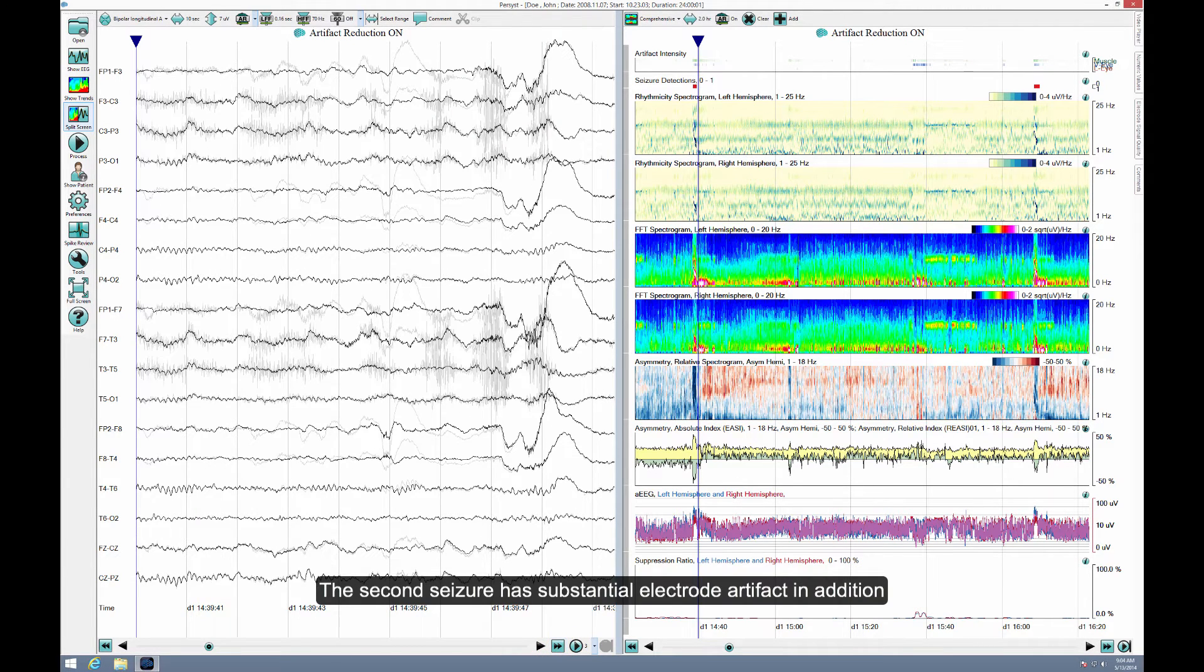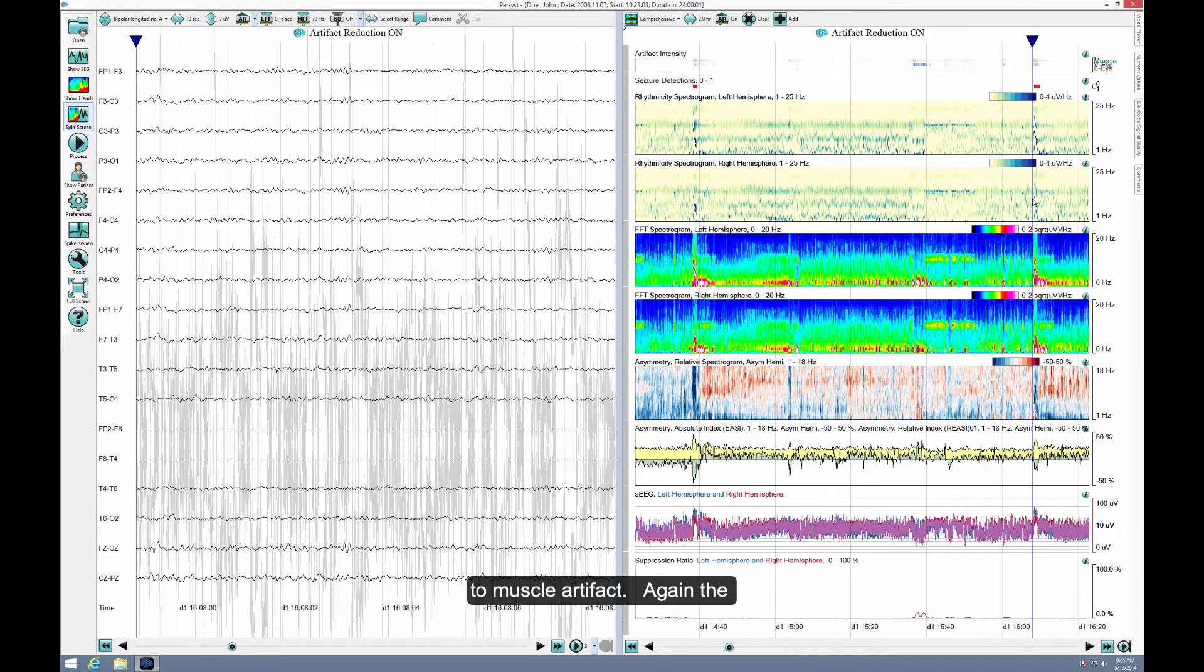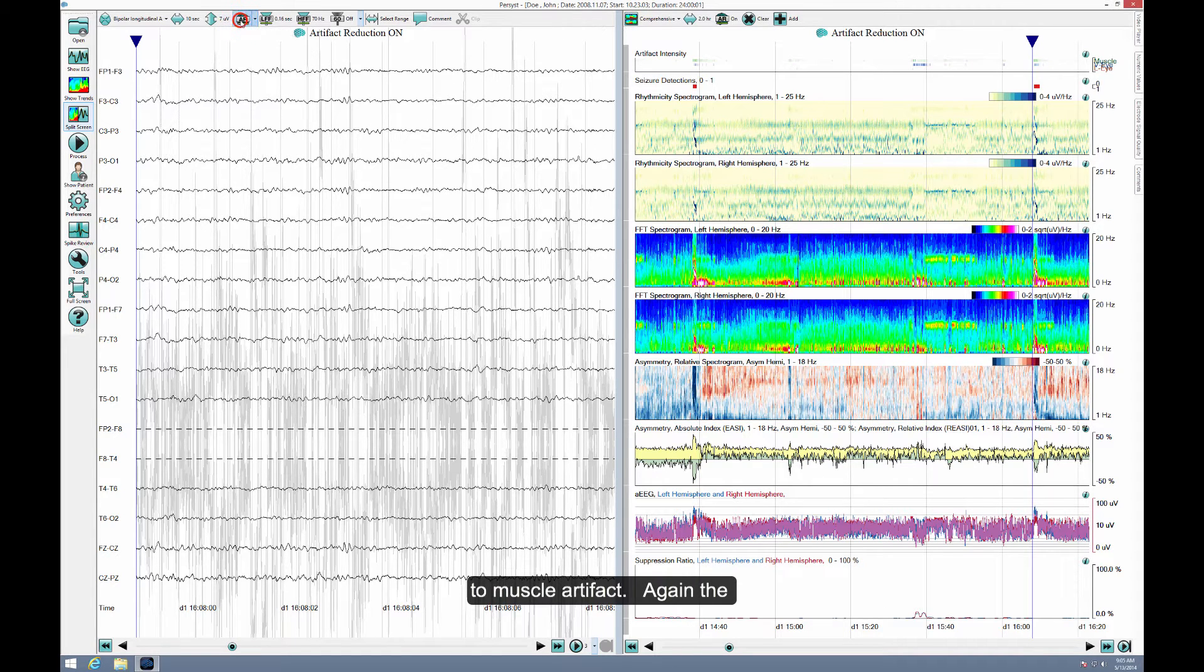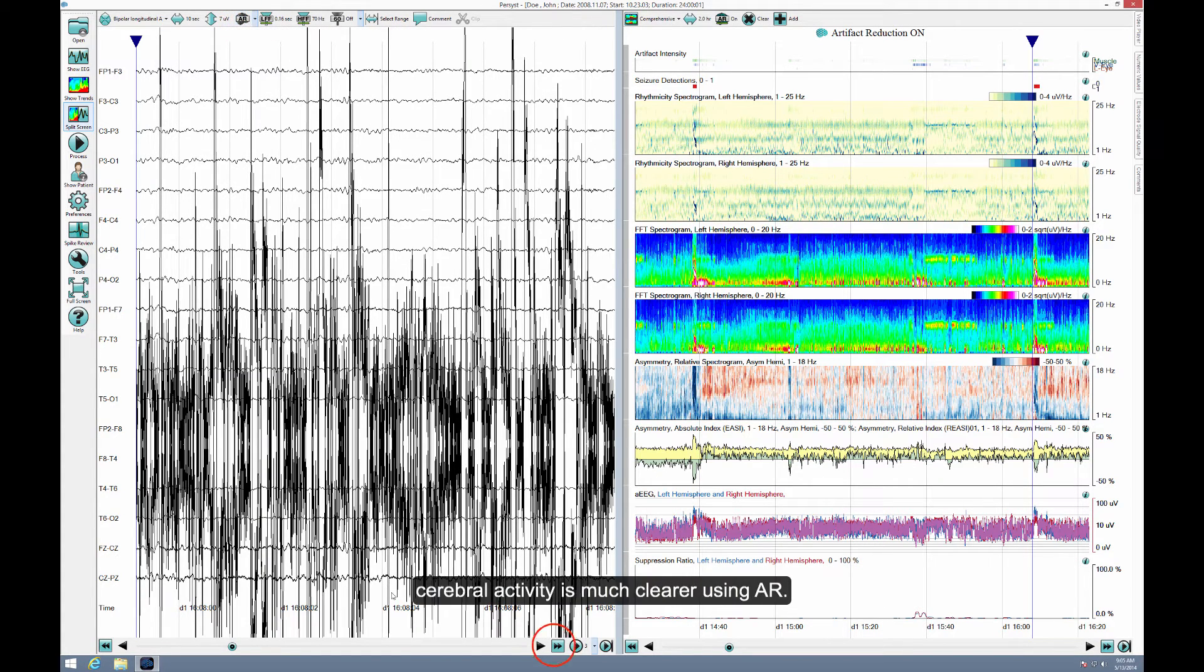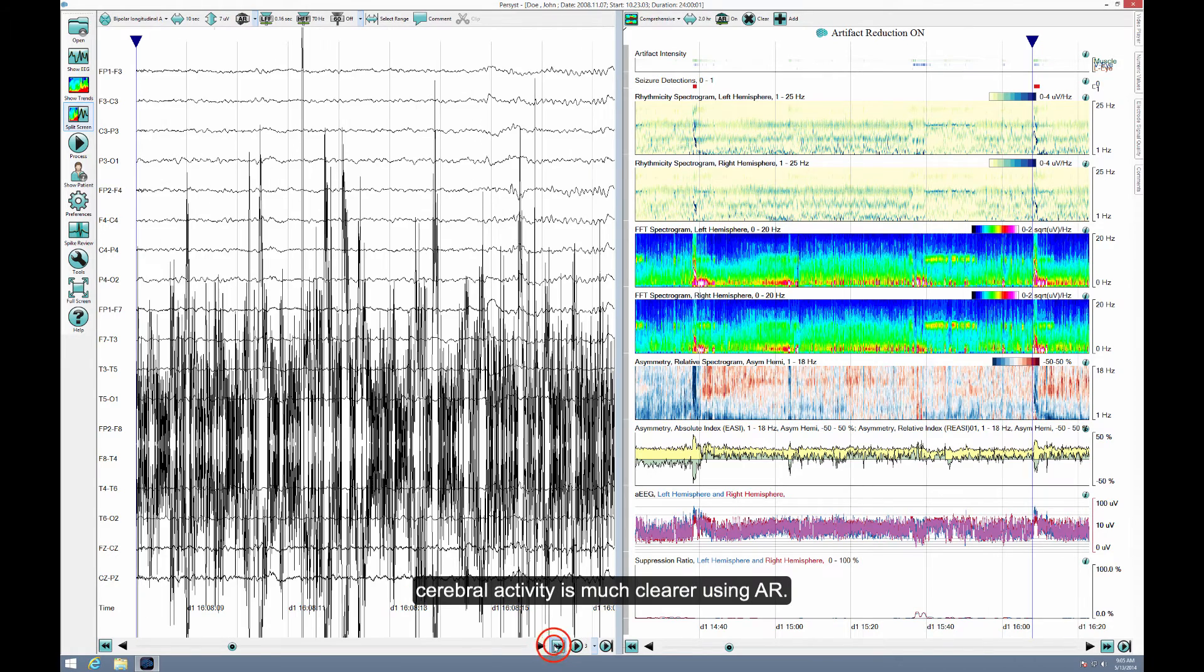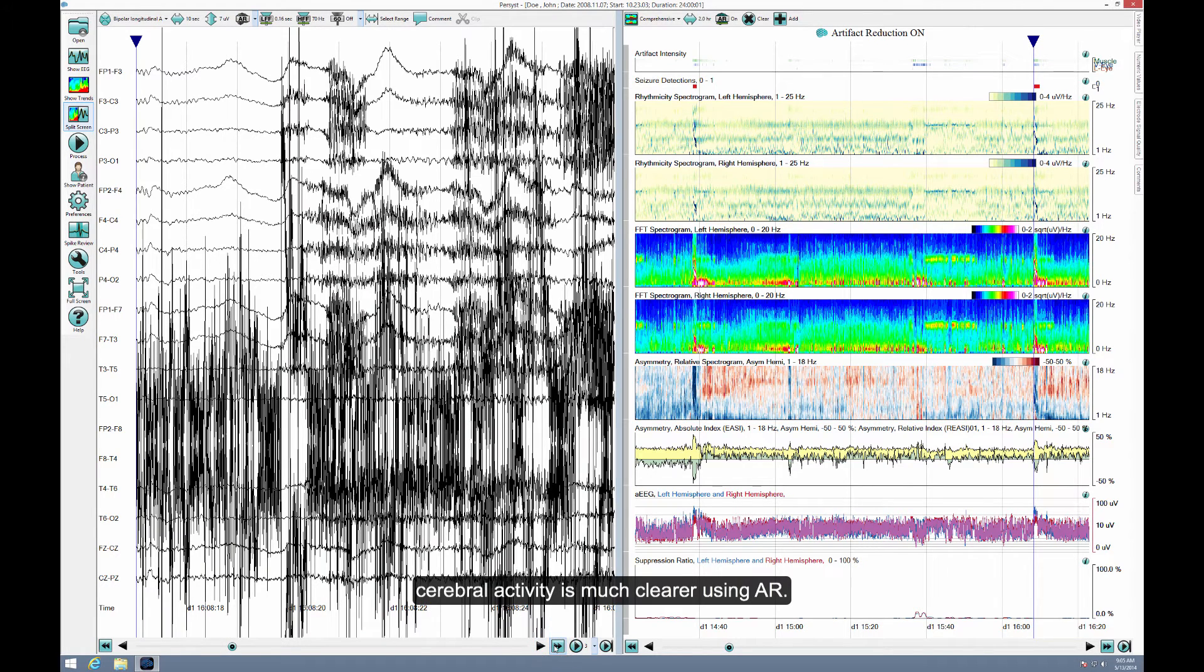The second seizure has substantial electrode artifact in addition to muscle artifact. Again, the cerebral activity is much clearer using AR.